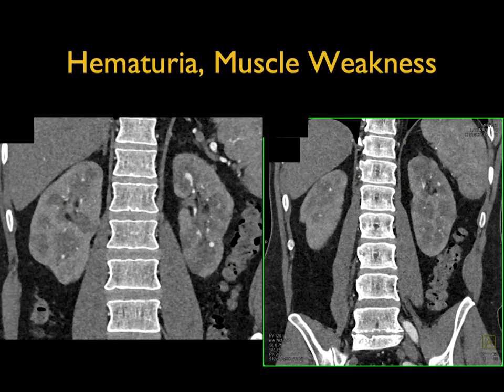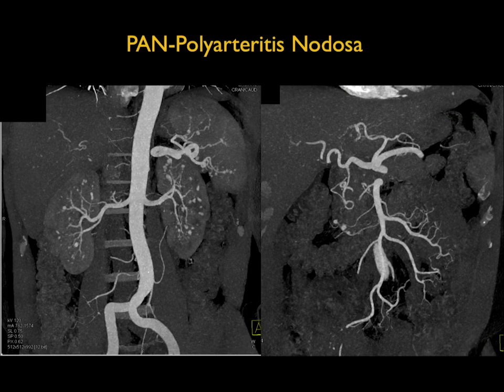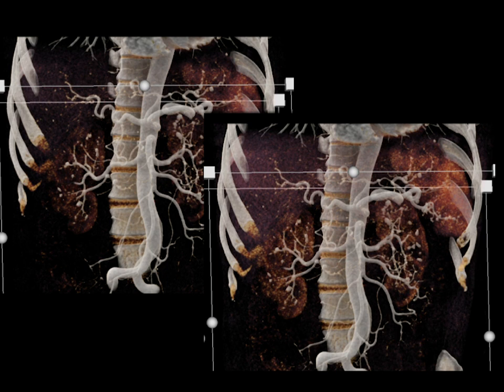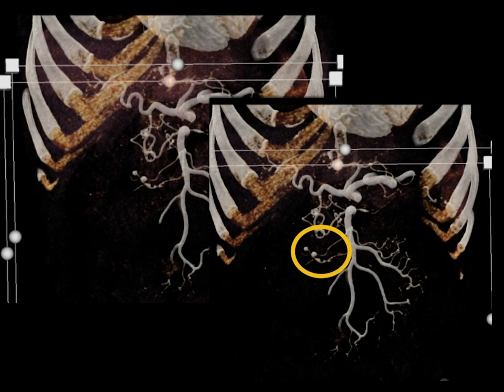Now in the kidney, we've done a lot of work there, but let me show you a few things on the vascular side. Patient with hematuria — look at those funny-looking vessels. They're particularly easy to see on the MIP imaging where you see the patient not only has multiple aneurysms of the renals, but also of the splenic artery and the SMA. This is polyarteritis nodosa. Look at the detail on the cinematic rendering of those vessels — just beautifully shown. You can see even the aneurysms that are two or three millimeters are nicely defined coming off the branches of the SMA.